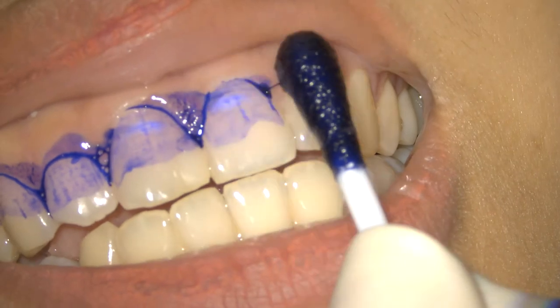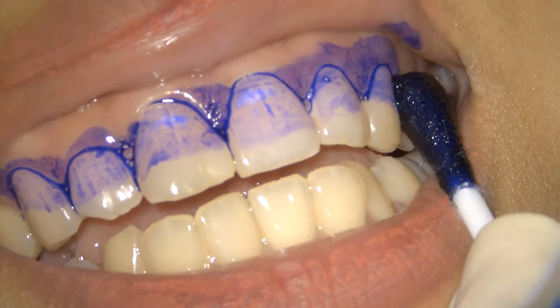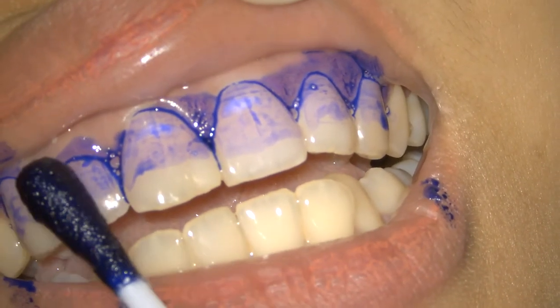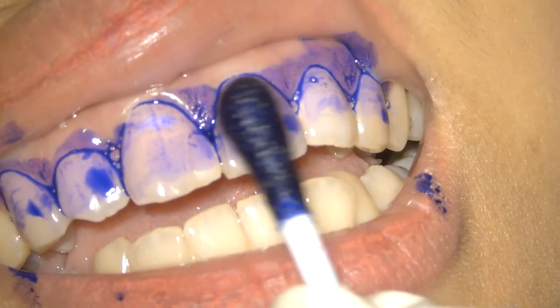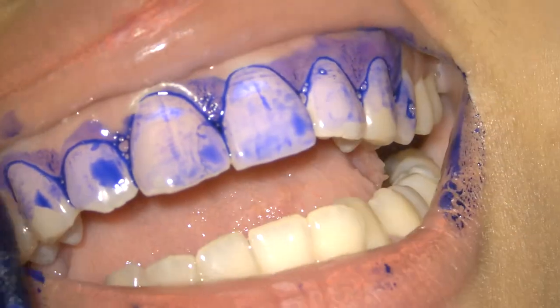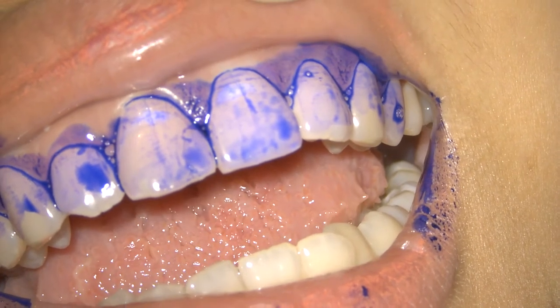You can see I have taken a sterile cotton bud, and I am applying this solution on the tooth surfaces. In this fashion you paint all the tooth surfaces with the disclosing solution.